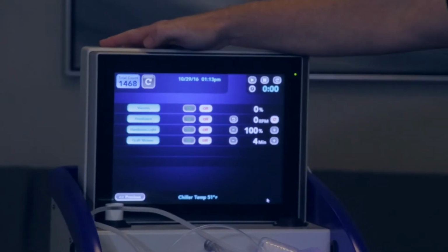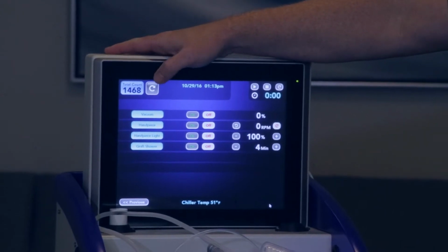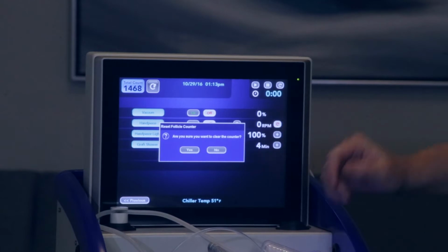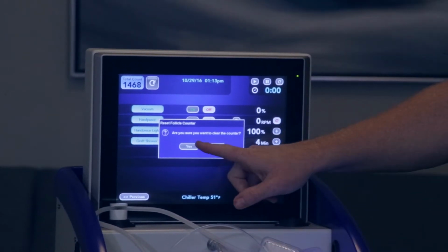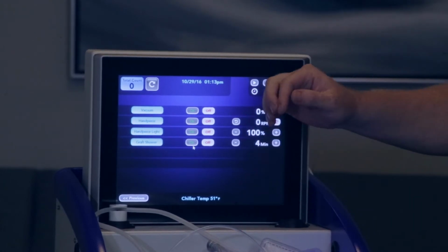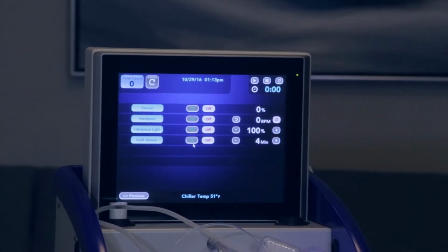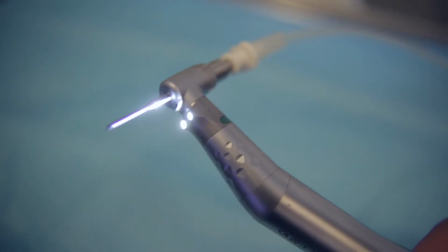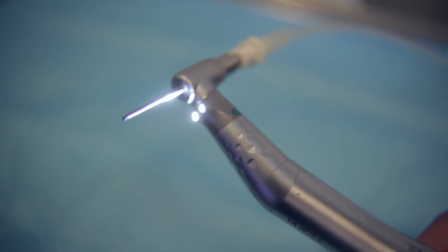To clear this, which there is a number there from a previous case, we would just hit this button and it would ask, are you sure that you want to clear the counter? You would depress yes. You have here vacuum, the handpiece motor, the handpiece light, which is actually an added function onto this. It does provide a really good light source for you.